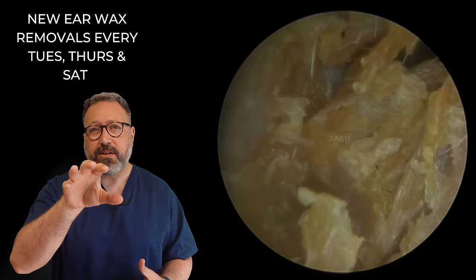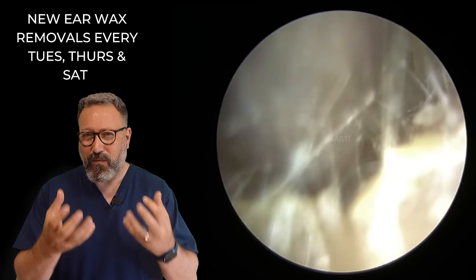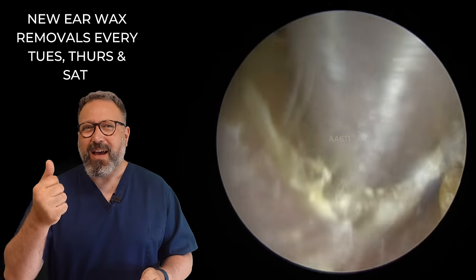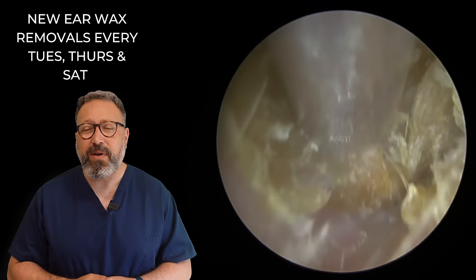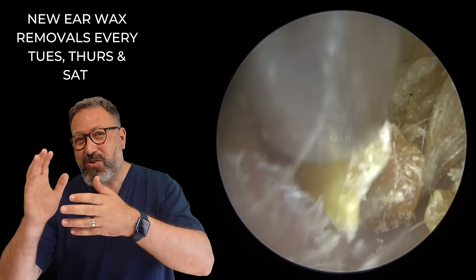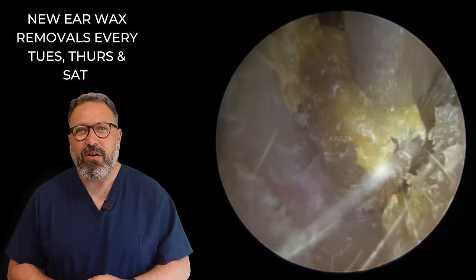I'm using the standard size suction tube to remove some of this wax. What I'm trying to do is lift it from the canal wall, but you can see the canal wall skin itself is very, very dry. This is almost layers — layer upon layer of dry skin and wax, all mixed together forming this very hard, quite sticky substance that's really difficult to peel off the canal. We're just giving it a little wiggle, trying to pull this off. You can see the layers as we lifted that up — how much it's stuck to the canal. You can actually see the canal wall skin pulling with it as we go down. Just a very, very tough plug this one.